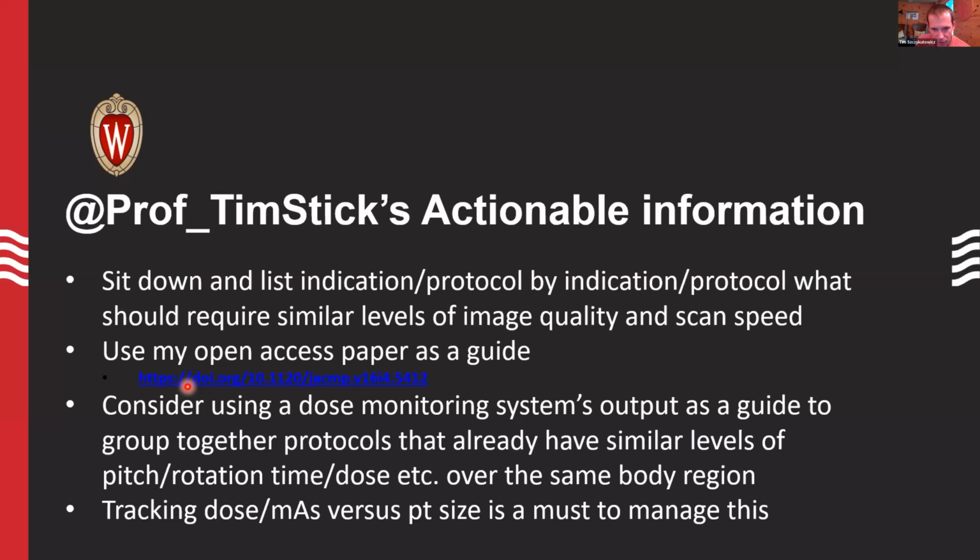Consider using a dose monitoring system's output as a guide to group together protocols that already have similar levels of pitch, rotation time, dose, etc. over the same body region. Yeah, so I've been talking a lot about using dose analytics, right, to make sure you're doing the right thing, but you might have some protocols that are not used very often. So if you have all this data on different protocols that you know are using the same acquisition techniques over the same body region, you can pool those together.